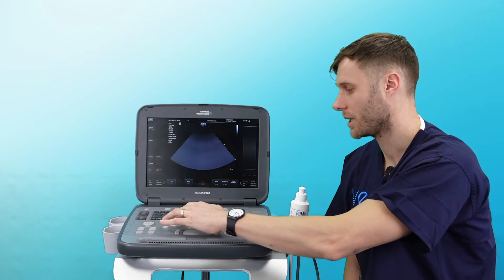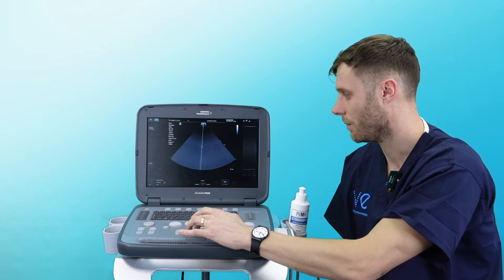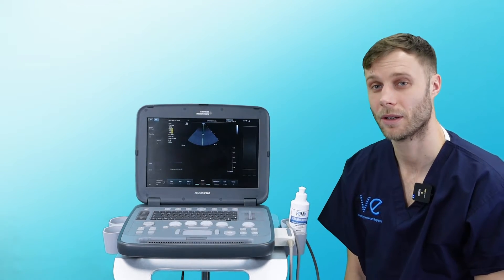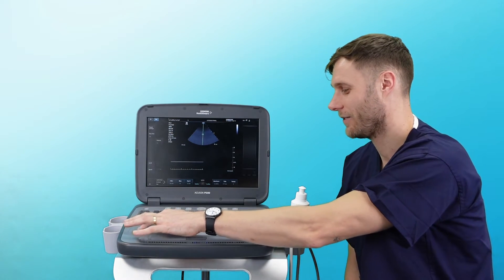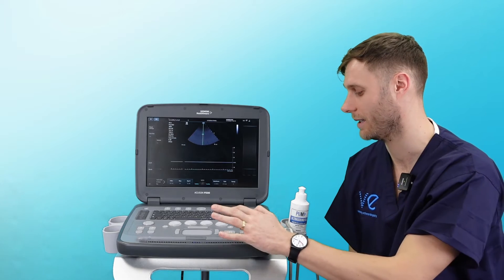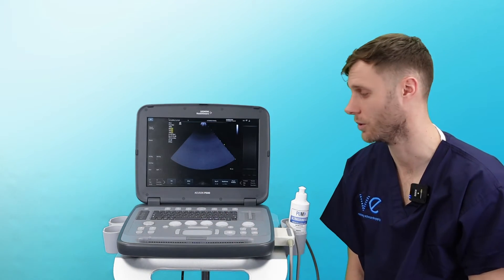Pulse wave and M-mode work the same way. I can hit PW, adjust where I want my PW cursor, and then hit PW again to start your Doppler. You then have your scale and baseline keys on the left hand side to adjust the scale and the baseline, and again once you're happy, 2D will reset it back to normal.